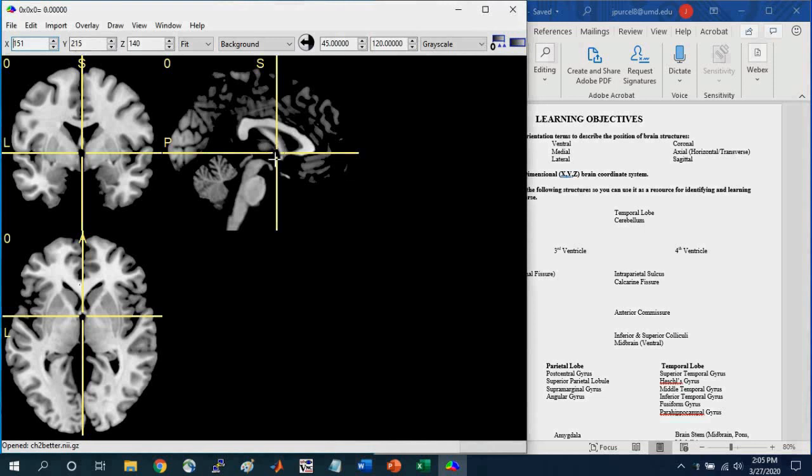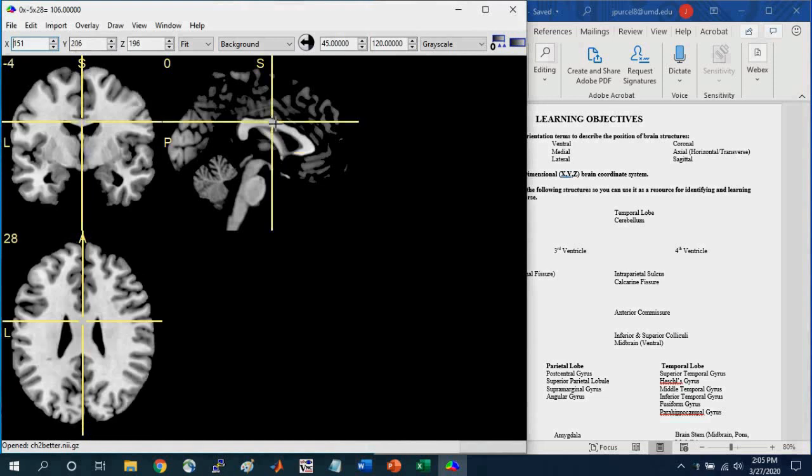If I select a wider portion up here in the corpus callosum, so a white matter tract that spans the two hemispheres, you see the intensity values up to 106.